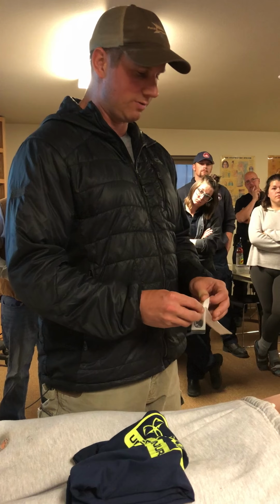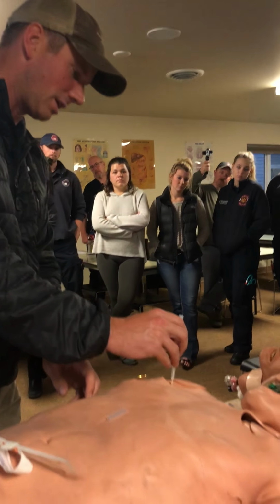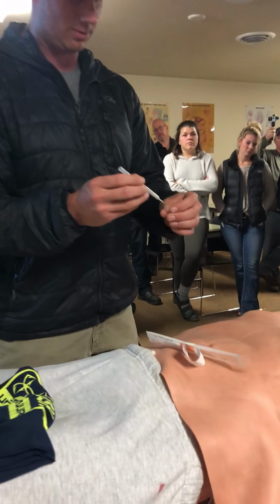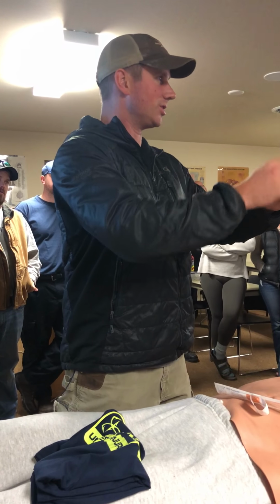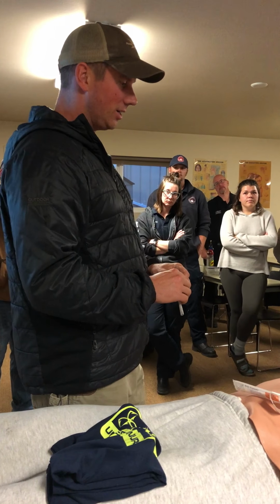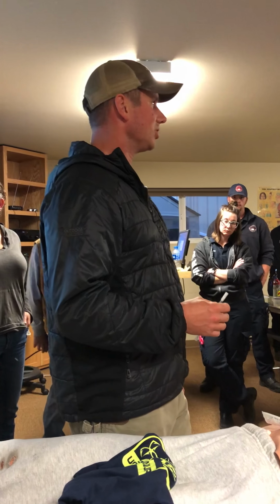Part of the reason I think we've had some unsuccessful attempts is that someone has a thick chest wall, and we're putting the needle in, and then there's recoil in the tissue. They have a lot of soft tissue. You push down, you dimple that soft tissue, and then it recoils, and the tip of the needle may come out, or the tip of the catheter once you remove the needle. I've seen that fail in real patients in the ER. So that's why this is another alternate site. Same technique, just a different site.